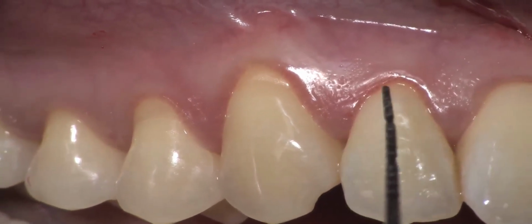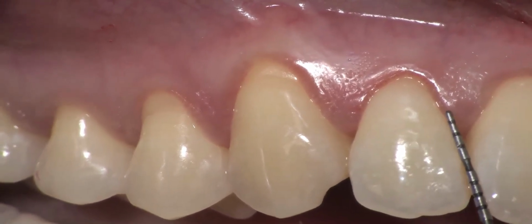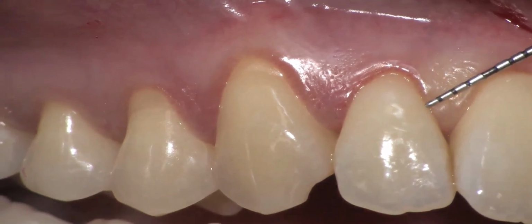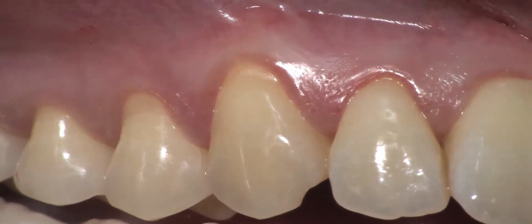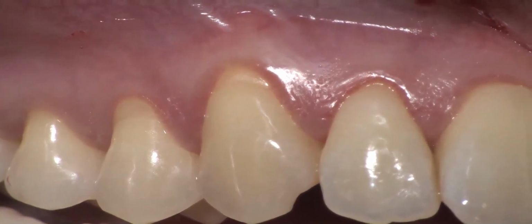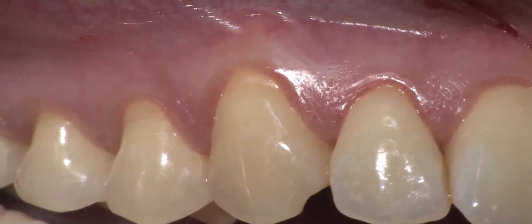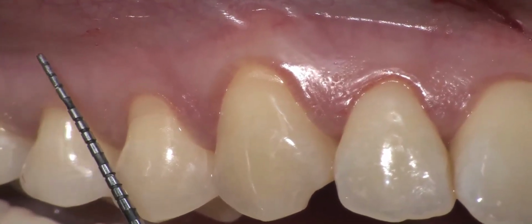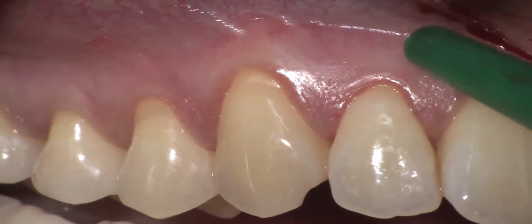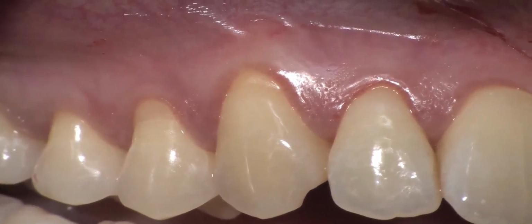Then we measure the very small 1 millimeter gingival recession of the lateral. We add 1 millimeter and we make another oblique incision from the central to the lateral. Since the 5 is completely healthy, instead of extending a flap to a tooth that is completely healthy, we will make an oblique incision, a vertical releasing incision, that is exactly the same shape as the other oblique incision.